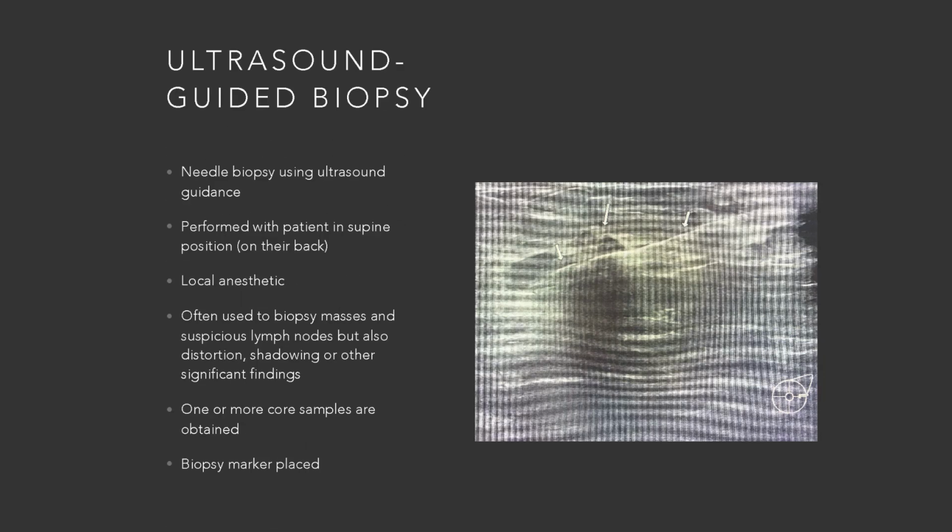For ultrasound-guided biopsy, we're using the ultrasound machine to guide us. Usually the patient will be in a supine position, so they're on their back, usually with their arm extended over their head.